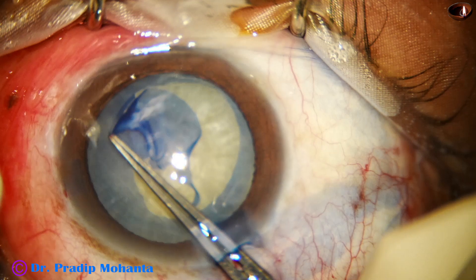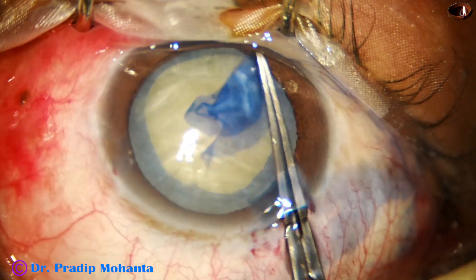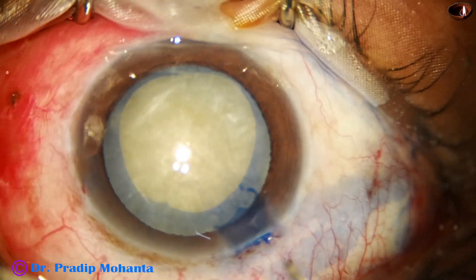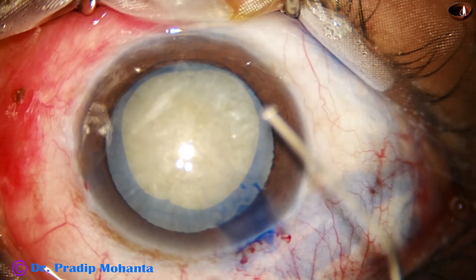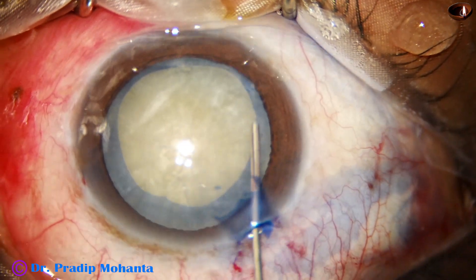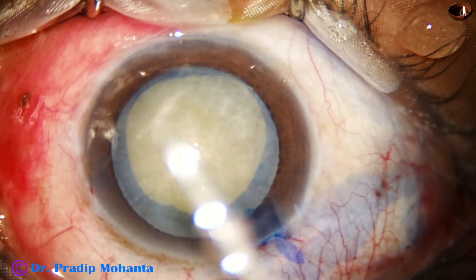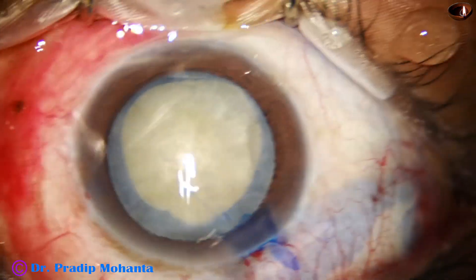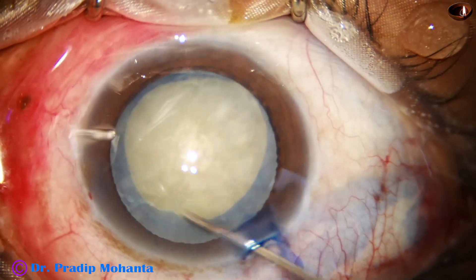And I could. So we have got a large rhexis, but it is continuous and it will accommodate an intraocular lens very nicely. The lens will be nicely centered and no problem will occur.